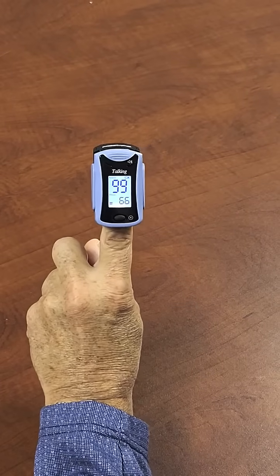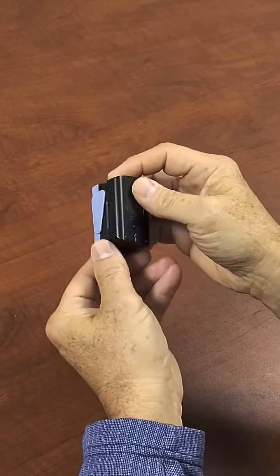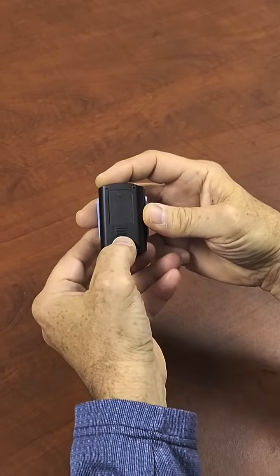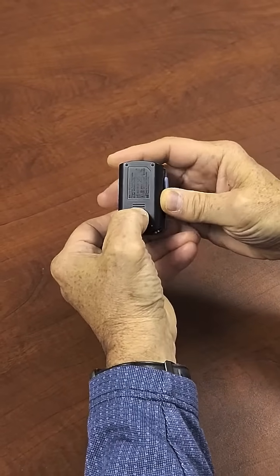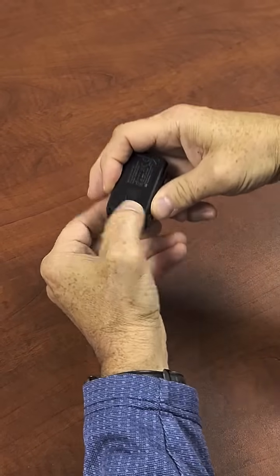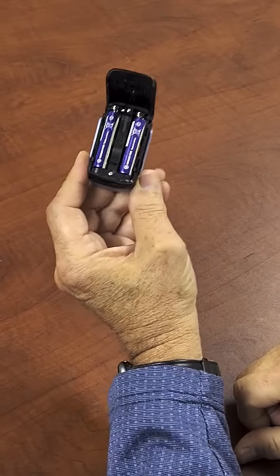If you want to learn how to replace the batteries or add batteries, we turn it over. We see there's a little button. You press down on this button and then press forward. This is hinged, so the hinge opens up, and there are the batteries.